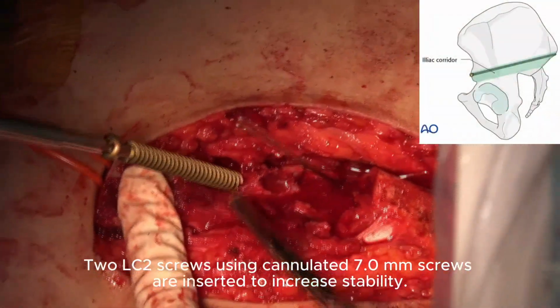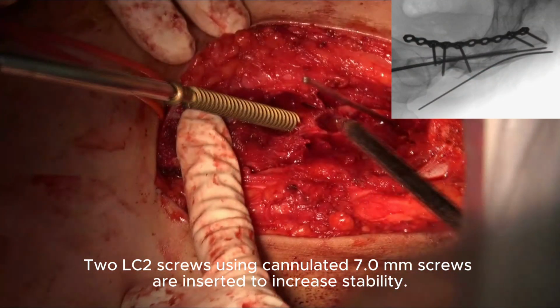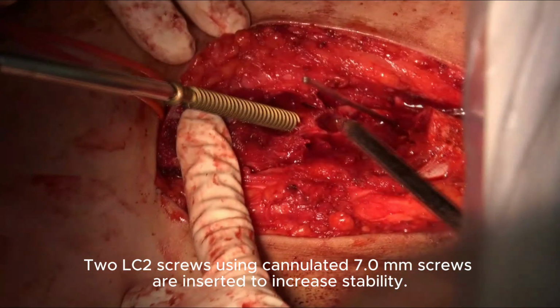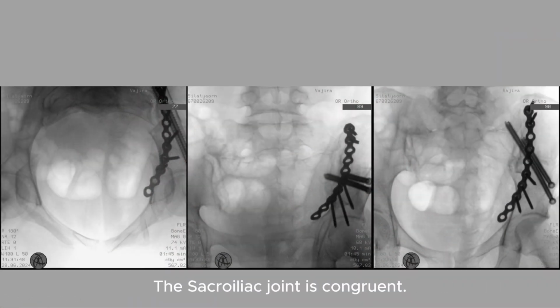Two LC2 screws using cannulated 7.0 millimeter screws are inserted to increase stability. The intraoperative imaging shows good alignment of the pelvic ring. The sacroiliac joint is congruent.